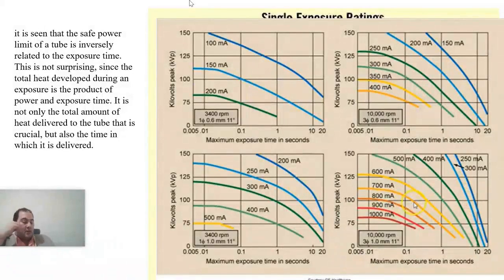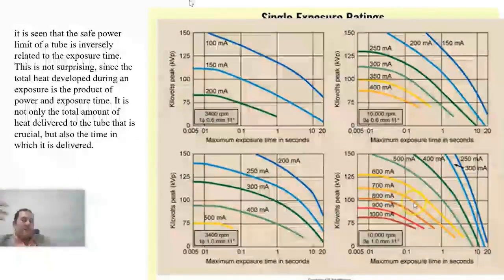So this might suggest reducing parameters so you can take all these scans back to back without the machine needing time to cool down. It doesn't necessarily have to be lower limb angiography. It could be portography or triphasic, and this is straightforward.